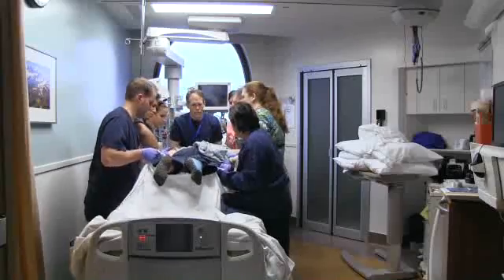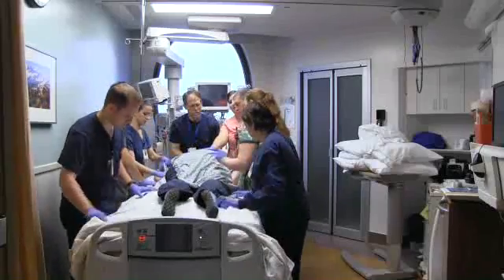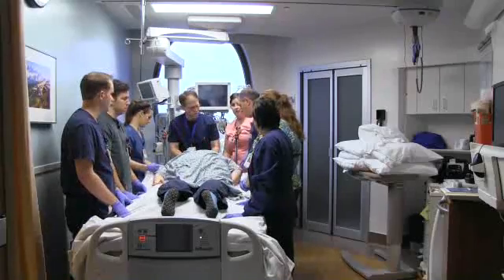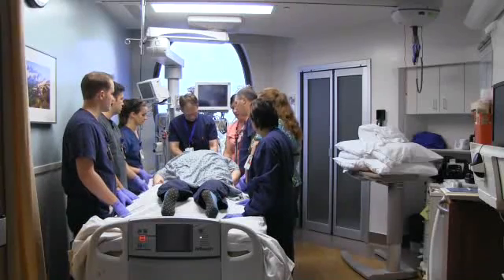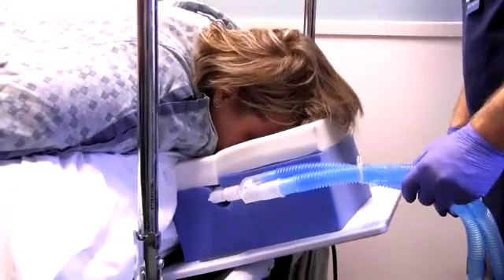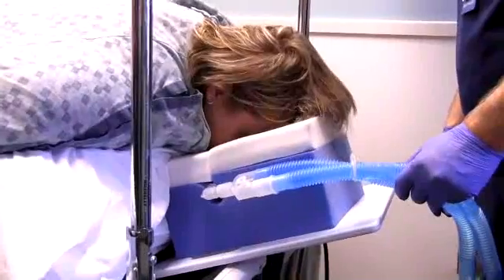She's now in a nice straight neutral position. Make sure you're getting leads on her back so she's back on the cardiac monitor. Then focus on getting her head in the proper spot. We've got the face pillow on a backboard situated at the top of the head of the bed so that her head is actually floating off the mattress. With the work of RT and one other person, position the tube in the proper spot. Make sure her eyes are in the hole at the top of the pillow and that the tube is in a neutral position so that we're not kinking it off.